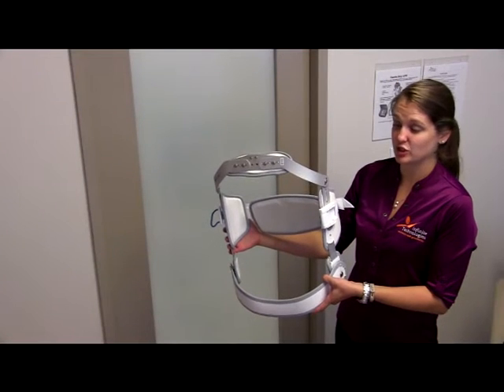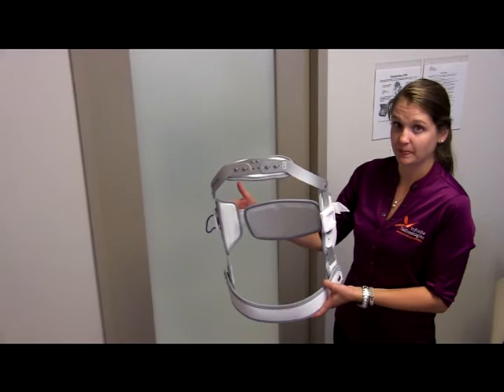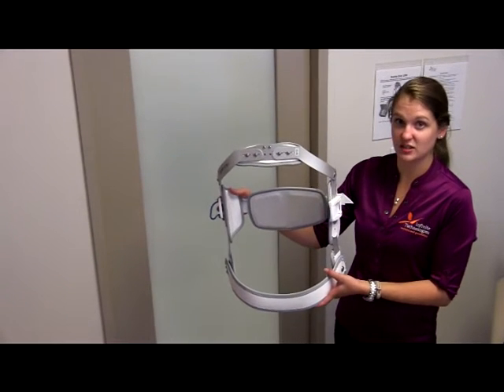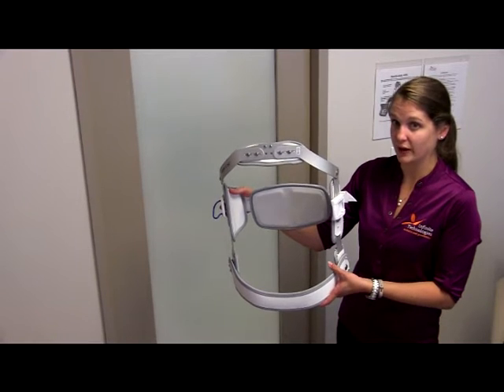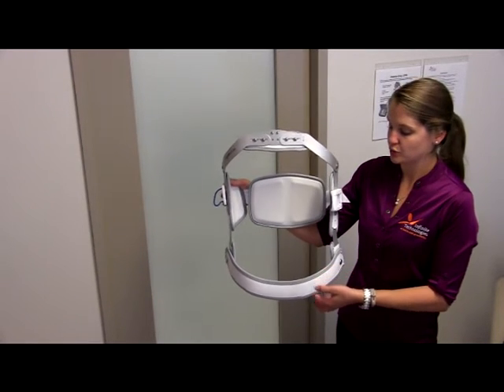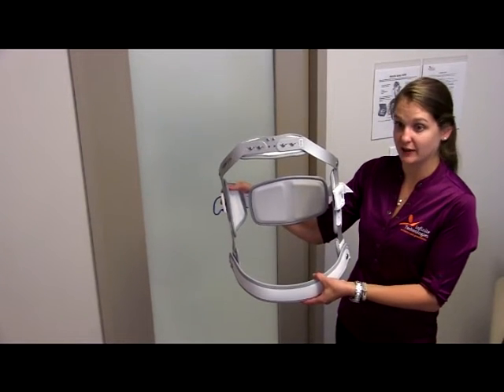Now we're going to review the donning procedures for the Jewett TLSO. The technique we're going to be using today is the log roll technique. This is for patients that cannot get out of the bed without the brace on, so we're going to be applying it to the patient lying down today.